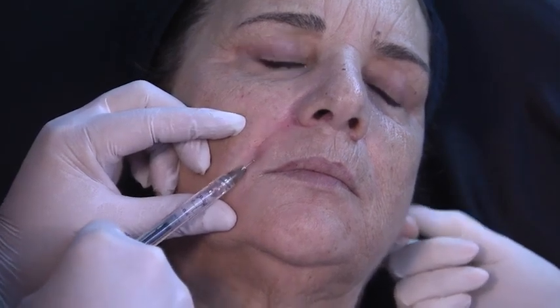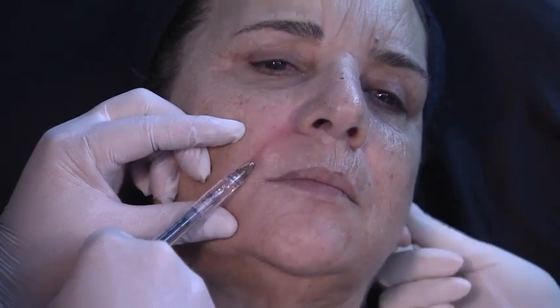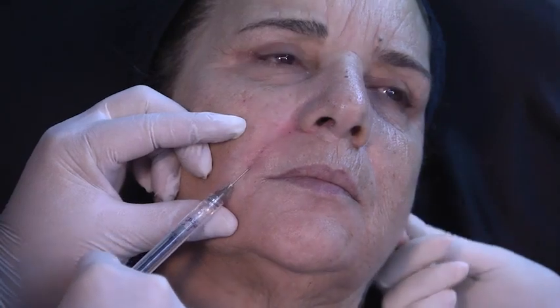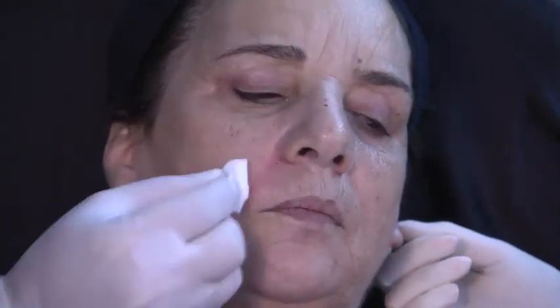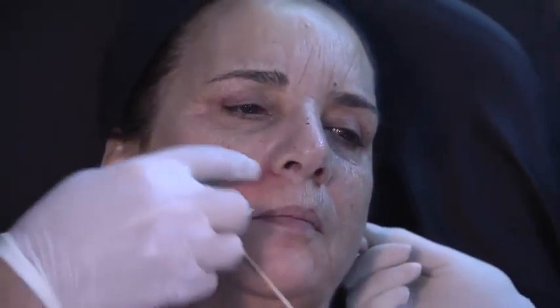Okay? Second point, I calculate the distance. I haven't touched, still clean. So second point, parallel to the skin. Okay? And that's it, very slowly, linear threading. And you're doing a retrograde injection. Retrograde injection. Right. Okay. And look at that. But I think that in the past I was doing superficial in this area, and now I'm more in favor of the deep, positioning the product deep, okay, to restore that volume.